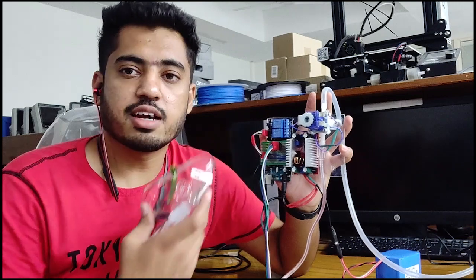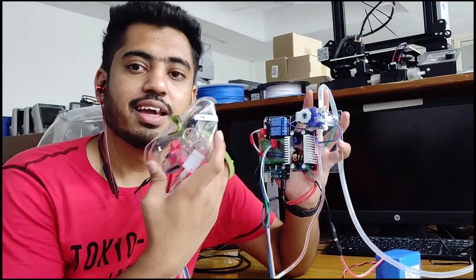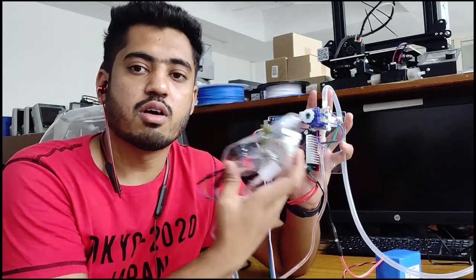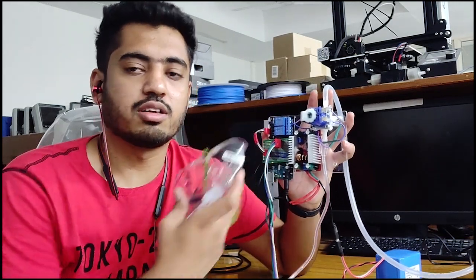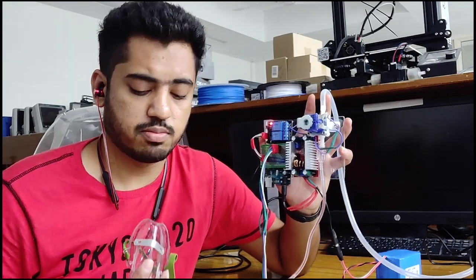This clicking sound that you can hear is basically the sound of opening and closing of this solenoid valve. Let us see that.